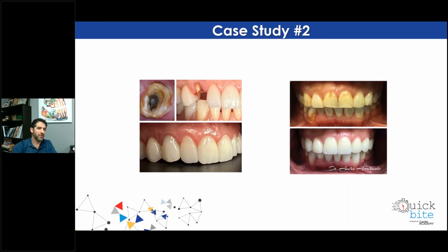So we made a metal post over it, and we put a Zirlux transition crown over it. You know, for having a metal post under this crown, I think it's blending really, really nice. We could not achieve the incisal we really wanted to match here, which is okay for a canine, as they're naturally a little bit darker, but we had to have some compromise. And that's one of the things we work on with our customers a lot, managing expectations. We're not magicians. We can do what we can with what we have, and we have the best.